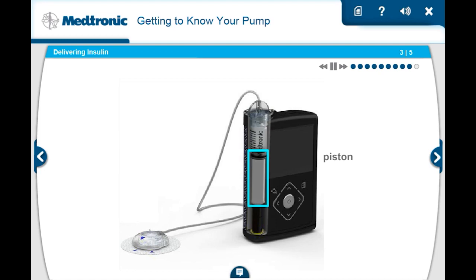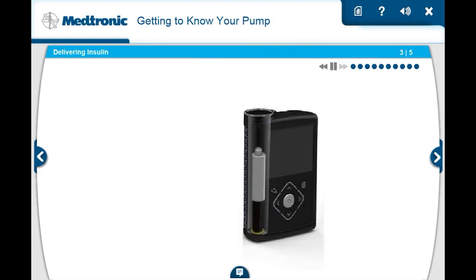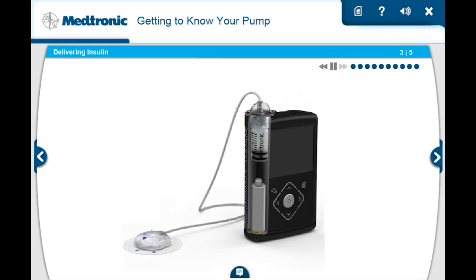Controlled by a mini-computer, the pump uses a piston at the bottom of the reservoir compartment to deliver insulin. The piston carefully pushes insulin from the reservoir into the tubing and then into your body. You'll change the reservoir and infusion set every two to three days. The piston will need to be rewound before a new reservoir can be placed into the pump.